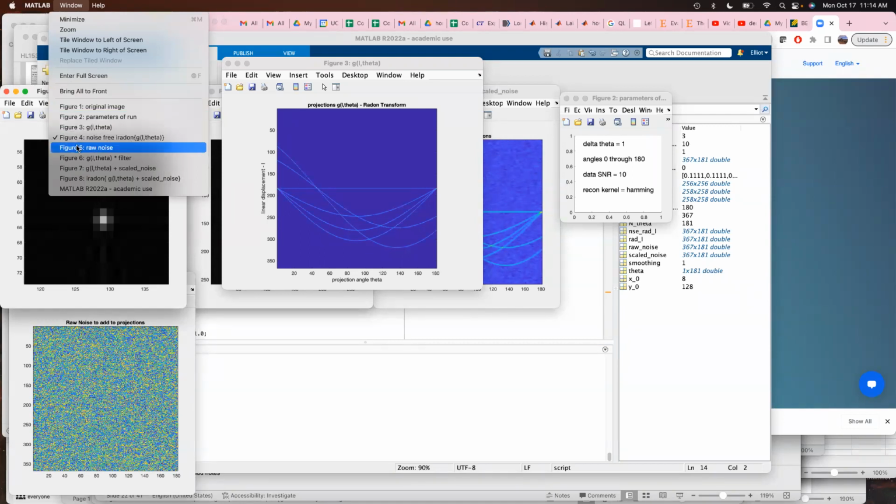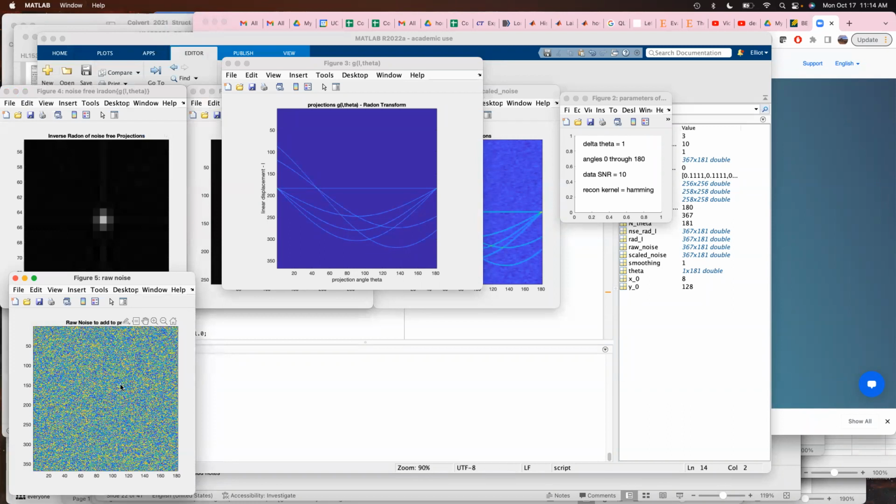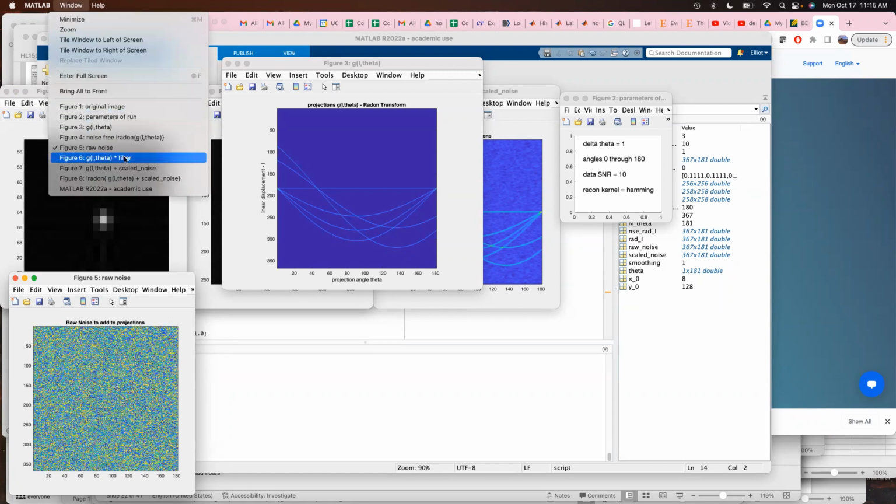The other thing that can happen is you can have noise on your raw data. And the noise comes from just electronic noise in the system and natural variability of the number of photons that you would imagine detecting. You're not going to get exactly the same number every time you do that measurement, right? And so there'll be variation. You can just model this as, say, a Gaussian distribution around some mean with random numbers that you would add to your raw data as a function of position.